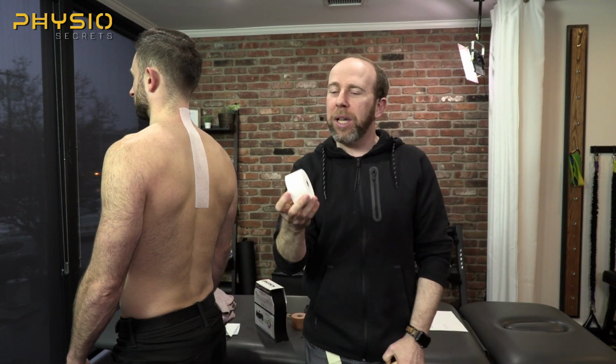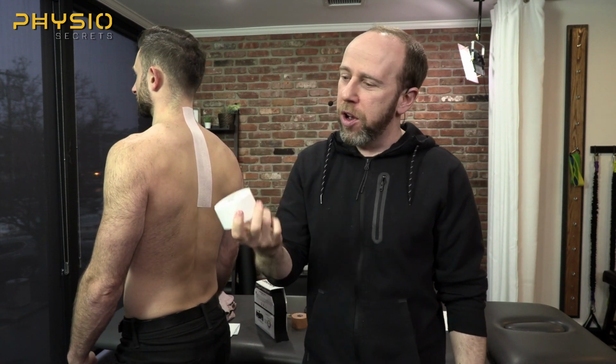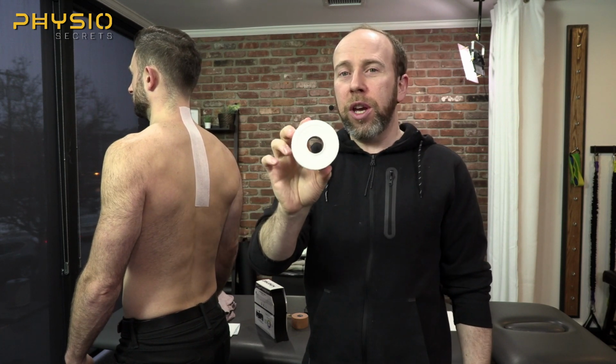We saw that athletic tape is really quick and dirty. It's really easy to apply, easy to rip, easy to put on, and it's cheap. The problem is that it doesn't really last very long. It's not really breathable at all, so it tends to get wet underneath when the person sweats, which means the tape becomes less sticky and basically falls off. So you know what this is really good for? Practice.